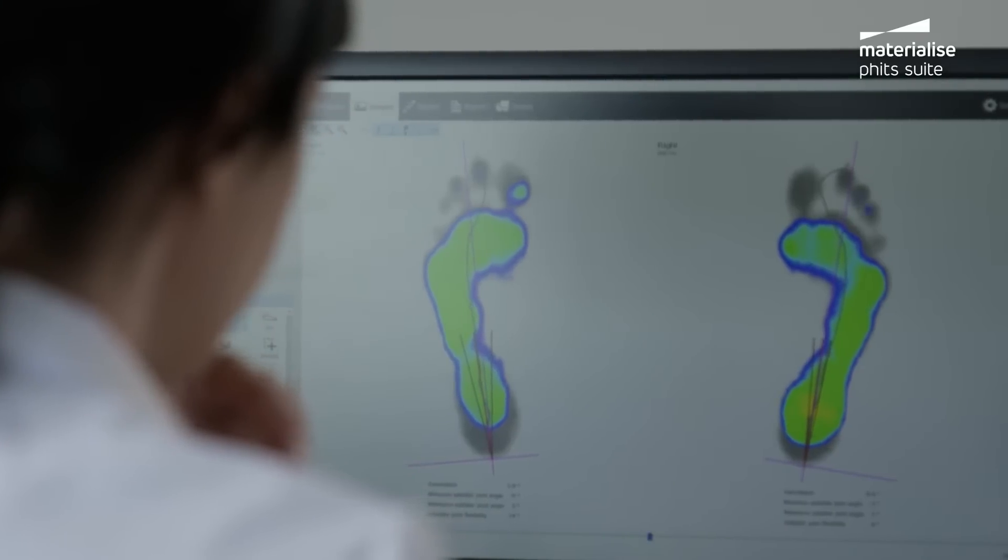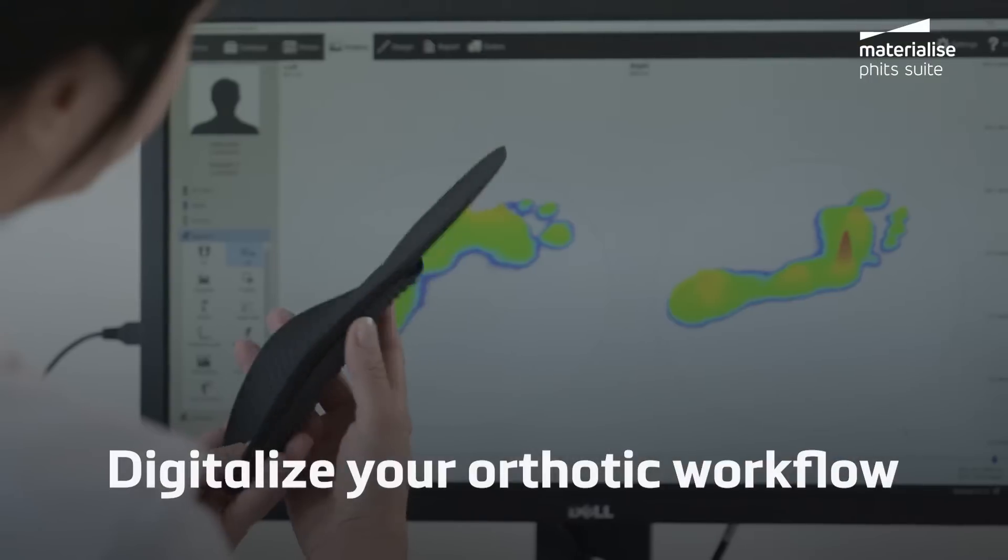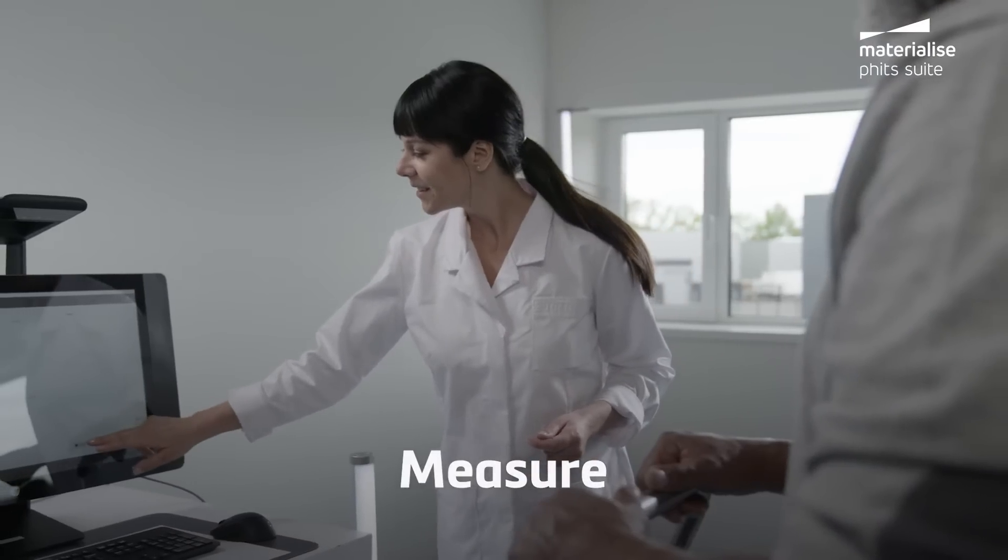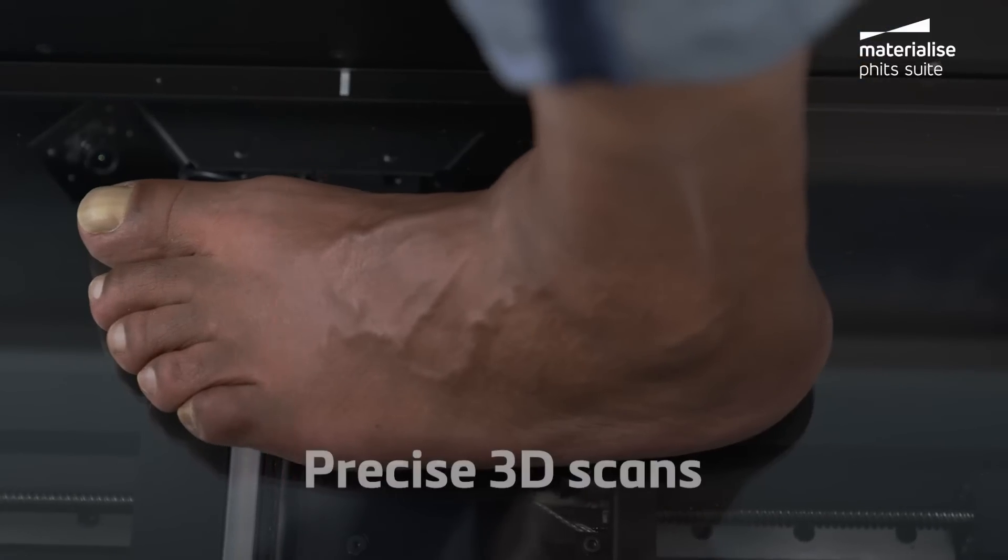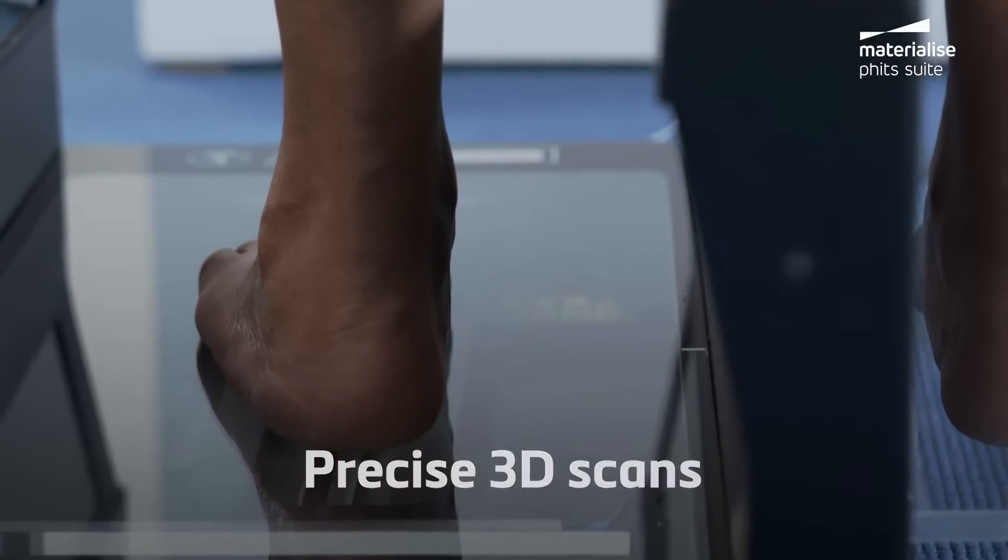Together we can digitalize every step of your workflow for a more efficient and reproducible process from scan to 3D printed orthotic.